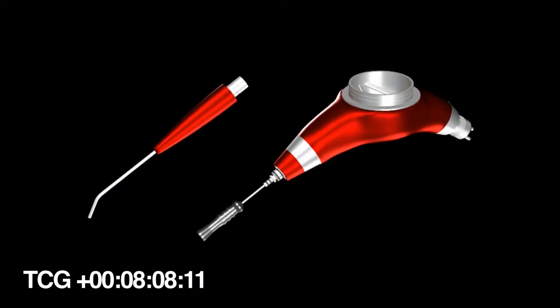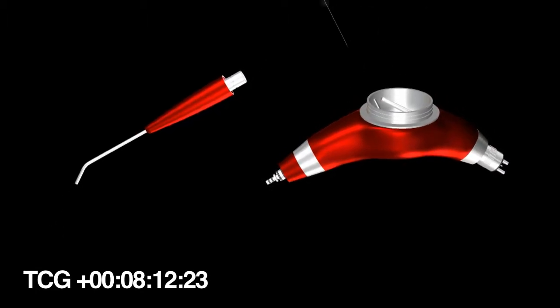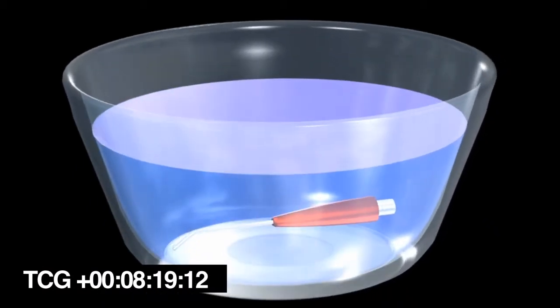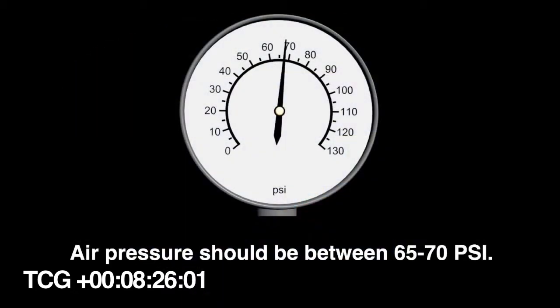Tip 2. If the nozzle is clogged, use your cleaning wires to remove the clog and/or soak the nozzle in vinegar or warm water for 5 minutes. We recommend soaking the nozzles as described at the end of each day so they're ready for the next day. Tip 3. Check the air and water pressure on the dental unit to make sure they're set properly. A good water spray is very important, and the air pressure should be between 65 and 70 psi.